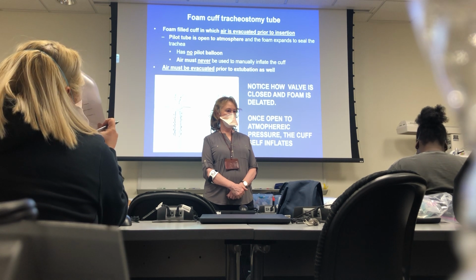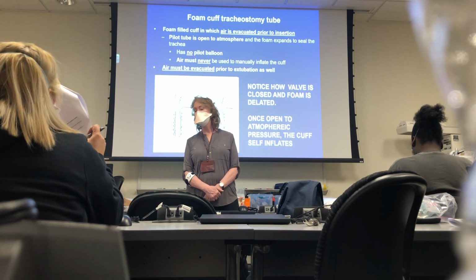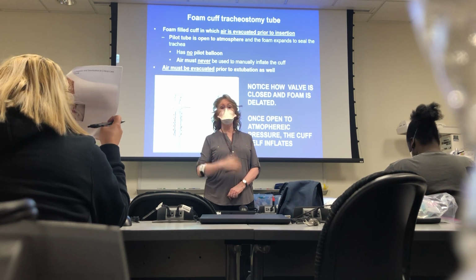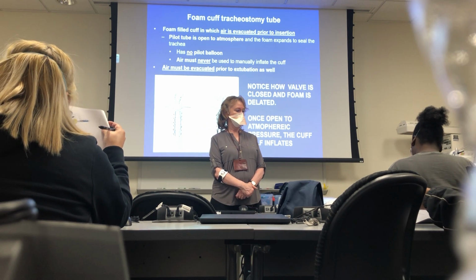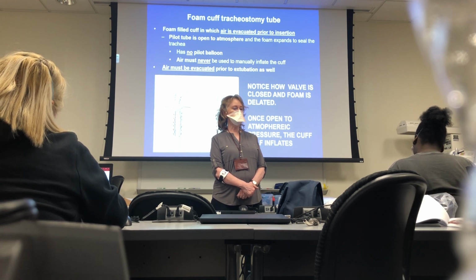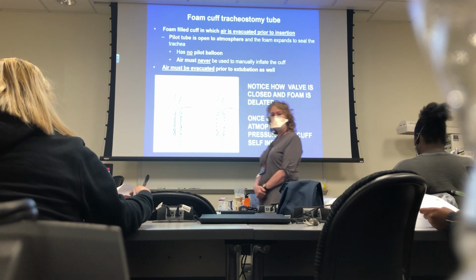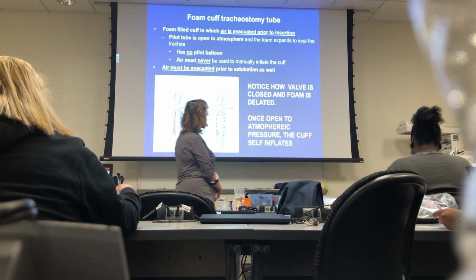This is it right there? Yep. King tube, yep. The Combitube, combination tracheal esophageal tube. Yep. Combination tracheal esophageal tube, one and two. Right, we got it? Everybody got it? Yep, did you find it? Okay, alright.